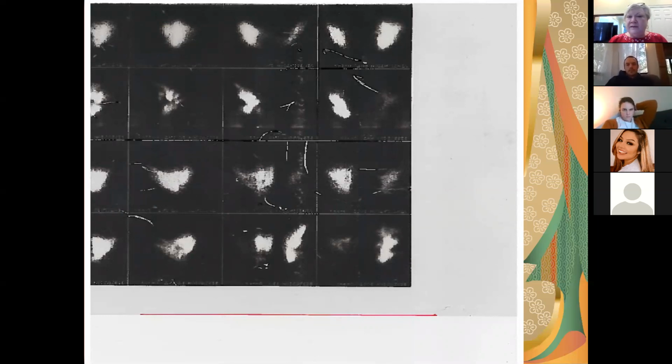It picked it up here. It did not pick it up here. So the fact that not both lungs were picking it up made this, the vascular side, the perfusion side, a high probability of a PE, VQ scan.